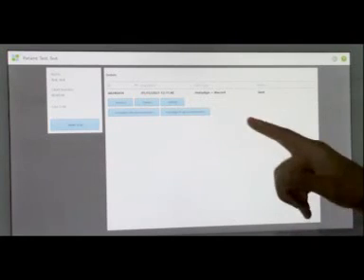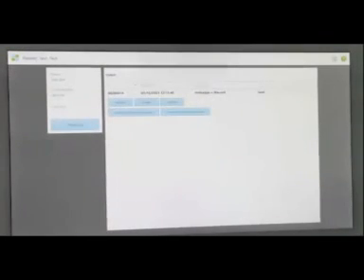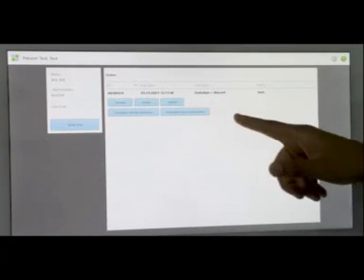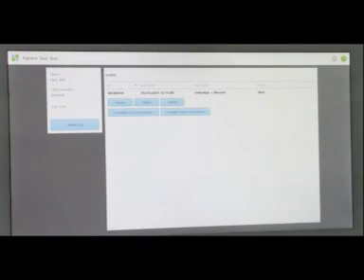Then, once you scan the patient more than once, there's one called time lapse, and that compares their first scan or 2 different scans to each other. For example, if I've got gum recession happening, how do I show a patient that, right? You scan me today, in 12 months you scan me again, then you can actually see the recession. So I can use it with the Invisalign progress assessment? You can, so this one is for Invisalign, yeah. Then once you scan the patient like 3 times, there will be one that says time lapse.